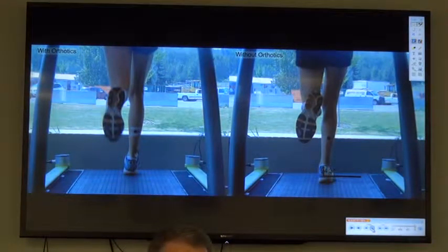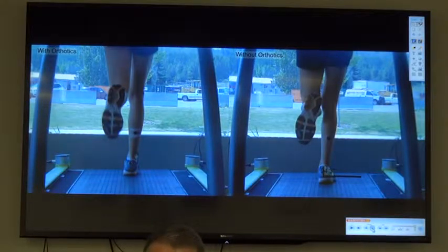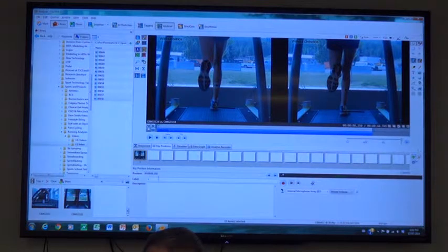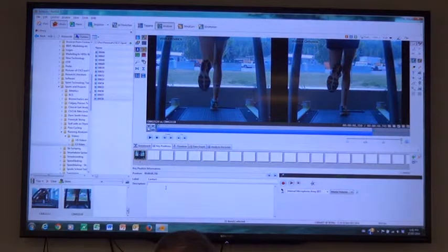Any bets? Whether or not the orthotics are working? So at contact, similarly, I would draw an angle, connect this dot to this dot, and then I would ascribe, so basically very close to the same. It was 79.9. This is 79.4. Capture that key position, call it contact, and then we'll call it 79.5 for rounding off. So very similar at the contact point.